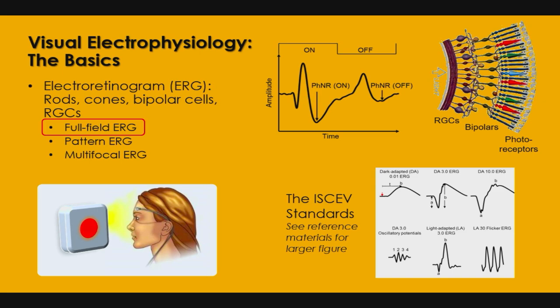Something I didn't mention earlier, but there's no problem going back now. The ERG wave, and I'm spending quite some time on this slide because when you get this slide, the rest are easy to follow. So the ERG wave has this negative dip, okay, or trough, right?